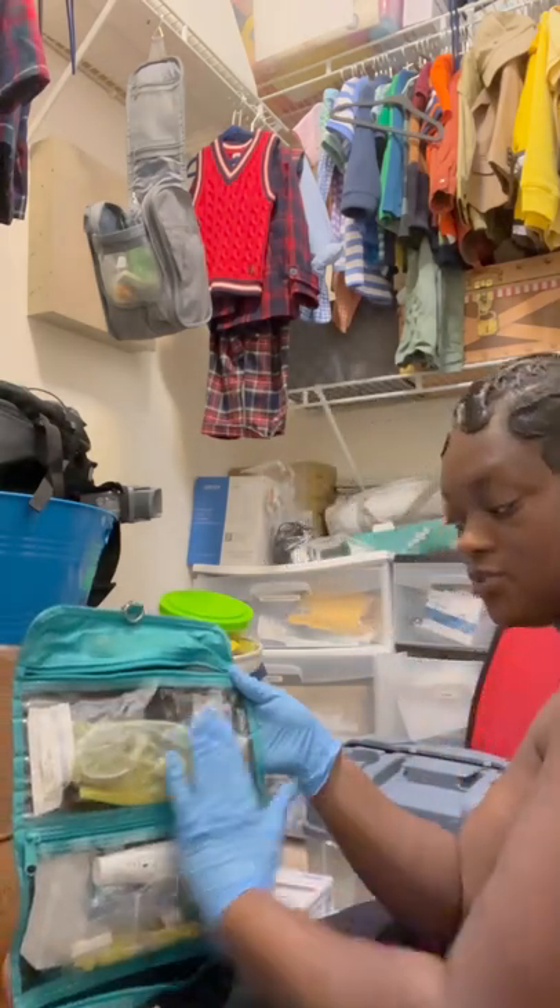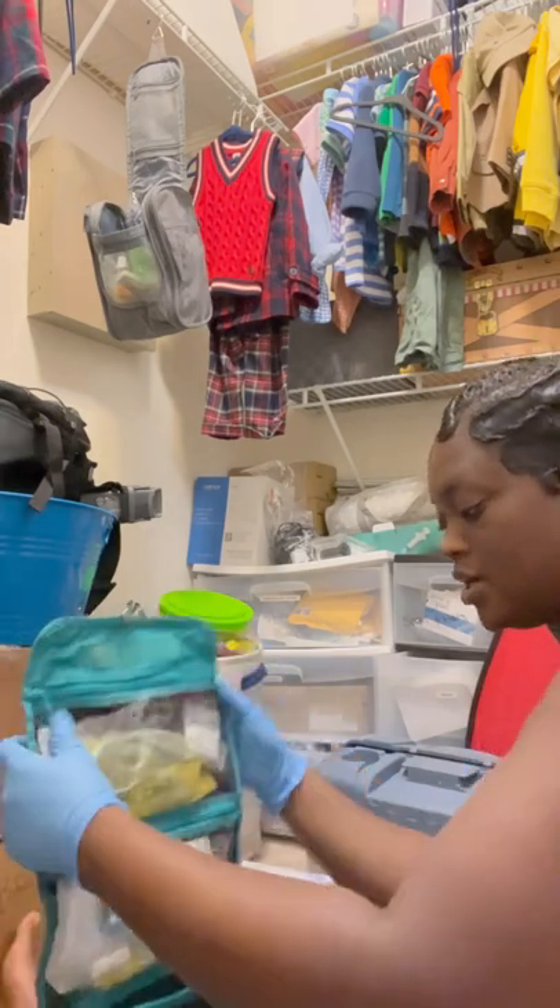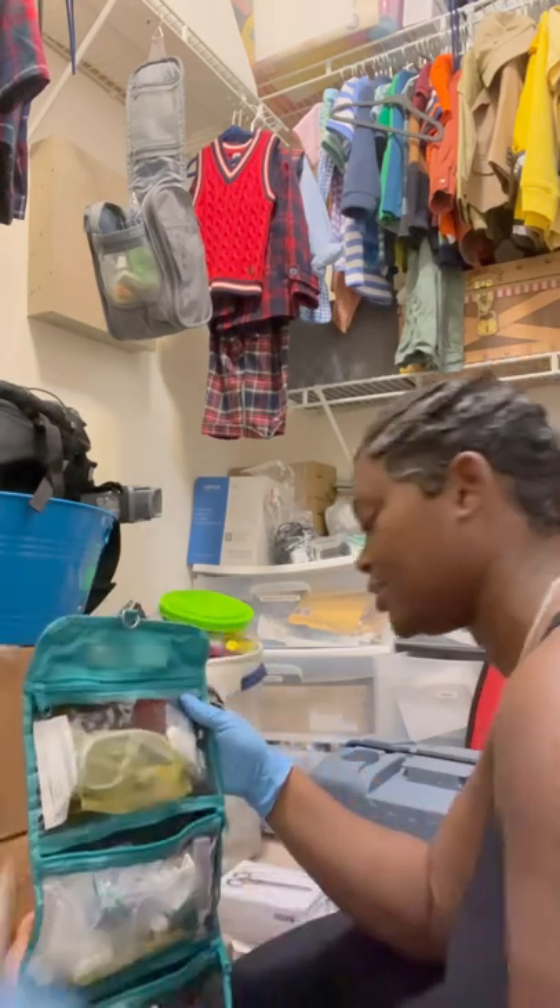For the emergency trach change, this is what goes in the first part of the bag. Now I'm going to go through the second part.